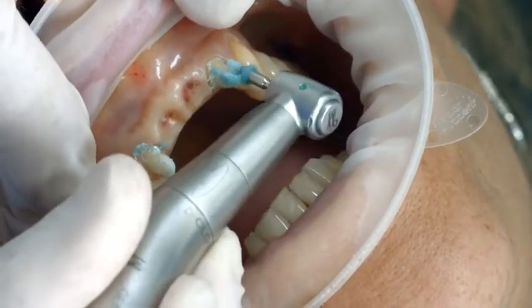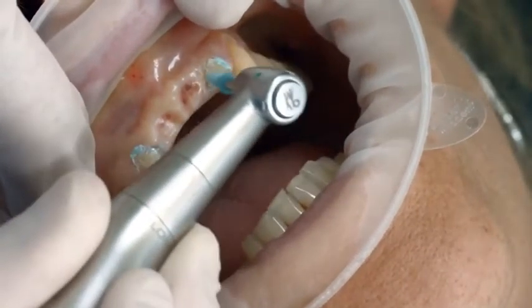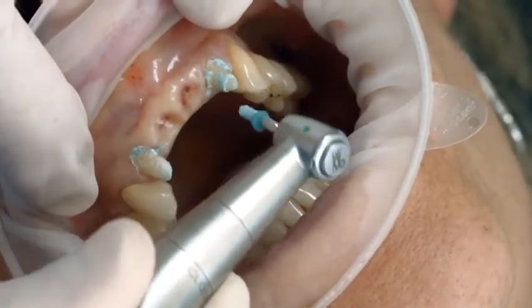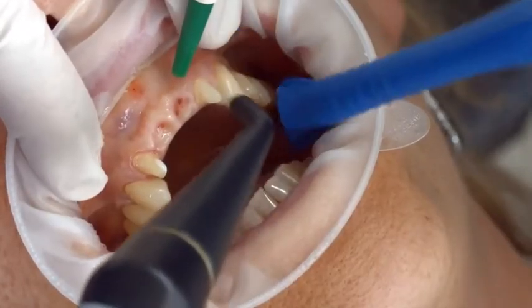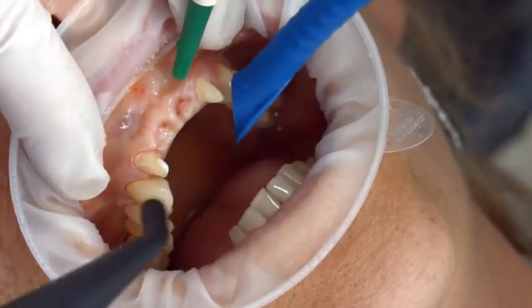Clean the cavity or preparation again with a polishing brush and an oil and fluoride-free cleaning paste, such as the fluoride-free Proxite. Finally, rinse the cavity or preparation with water spray and dry it with air. Avoid over-drying.